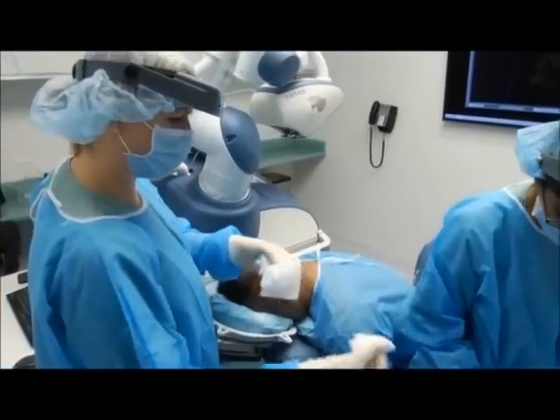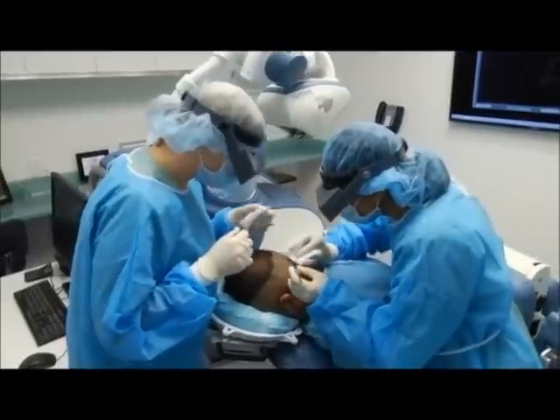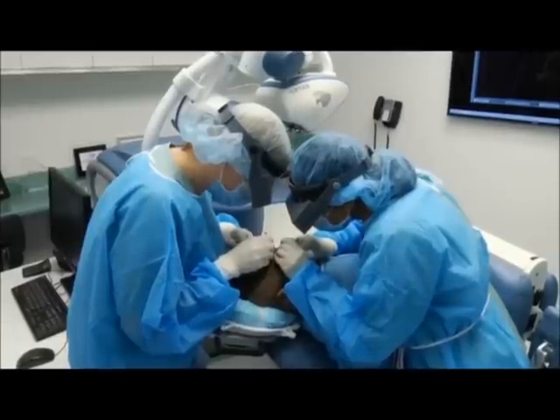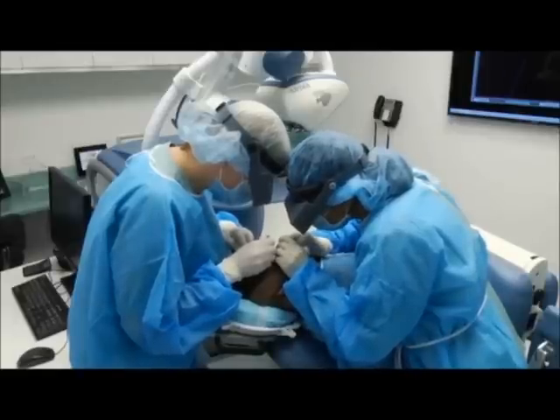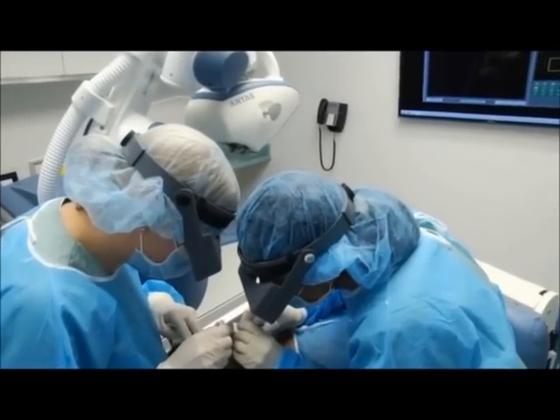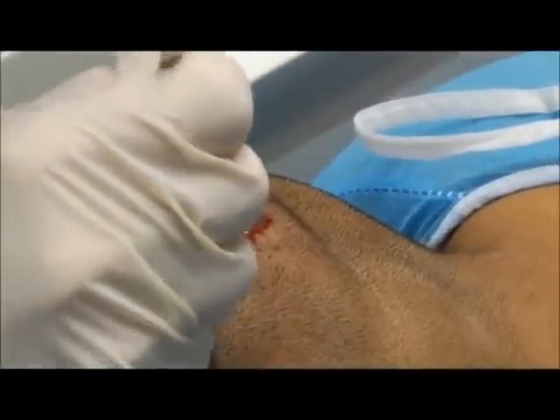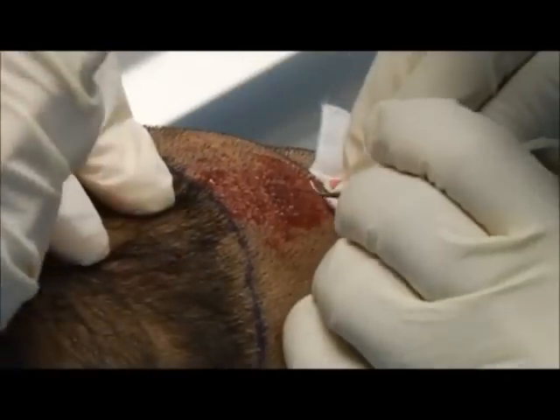The robot just finished harvesting the first grid — there were 109 follicle unit grafts. The team is now using serrated forceps to remove the follicle units from the scalp. These are placed in a solution of Ringer's lactate at room temperature and then immediately placed into chilled hypothermosol, which is a medium that mimics the composition of intracellular fluid so you don't get fluid influx in the chilled environment.